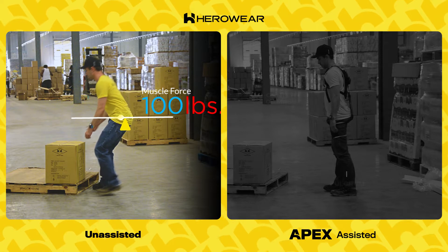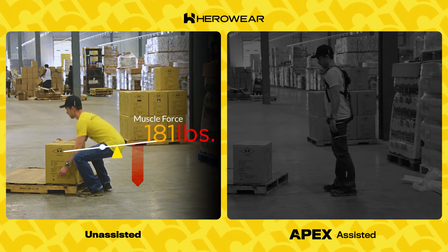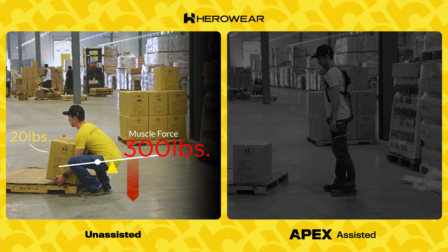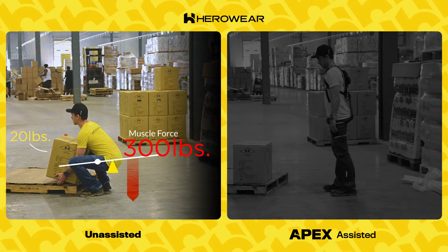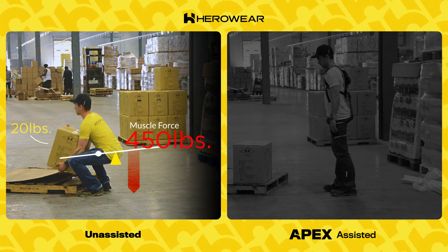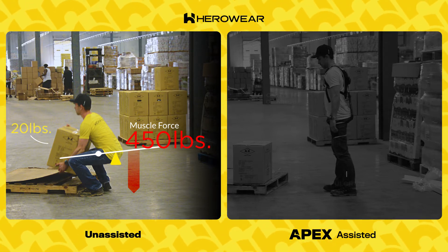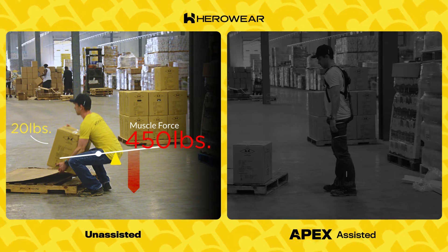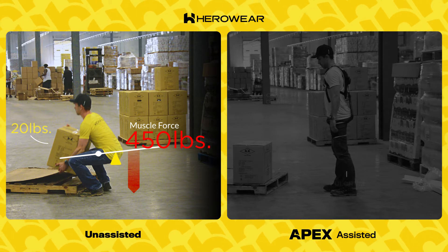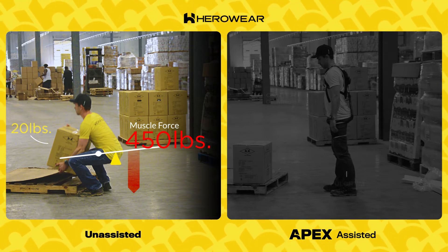His lower back muscles, located right up against that fulcrum, must apply a lot more force to hold him upright — they're already up to 300 pounds of force. Picking up the box increases these forces even more as his center of mass moves further out and he adds weight to the system. His muscles are pulling from attachment points at his shoulders, spine, and ribcage down to his legs with a whopping 450 pounds of force just to get a 20-pound box off the floor.